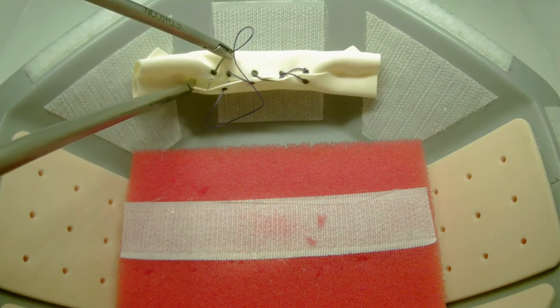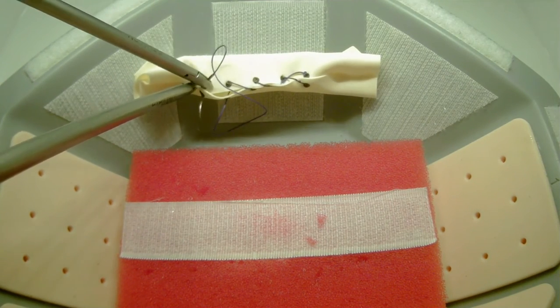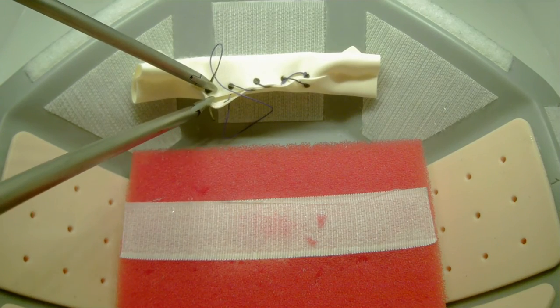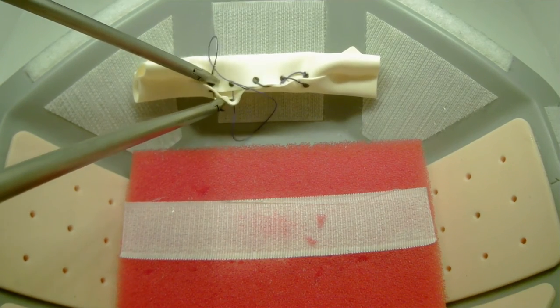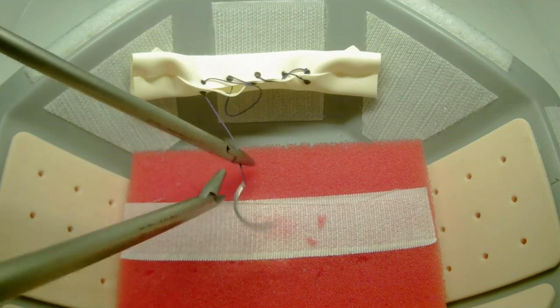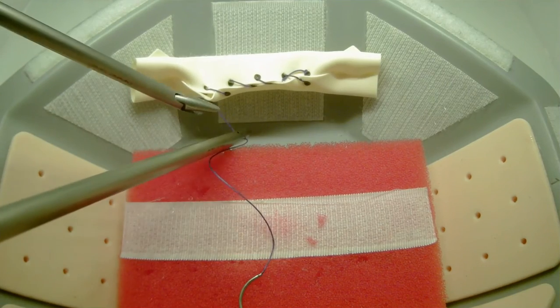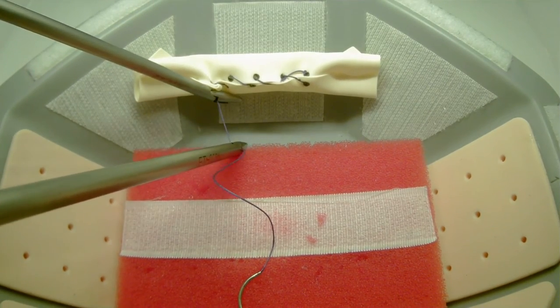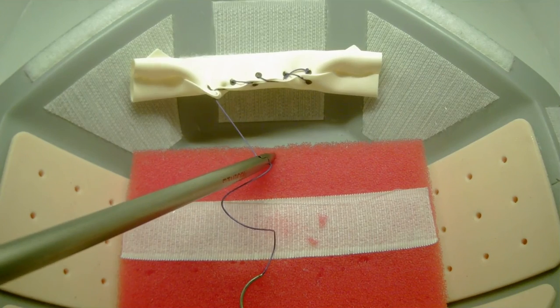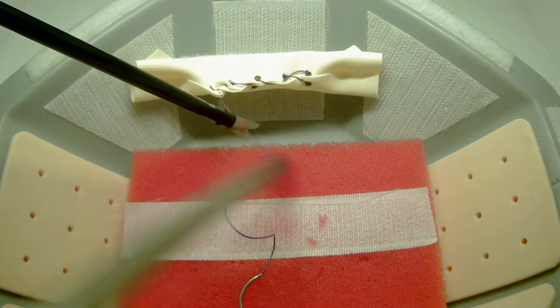You will continue running your suture. Although not demonstrated in the video, you are not required to pass the needle through both targets in one throw — you may utilize two throws if needed. To complete the task, you will not be required to tie a knot. You will pass your laparoscopic scissors into the trainer and cut the needle end off of the completed suture.